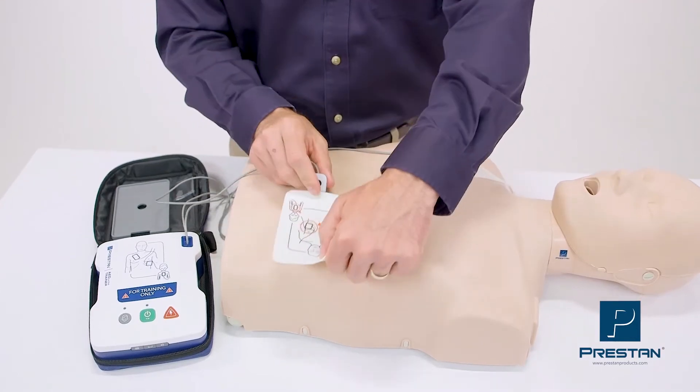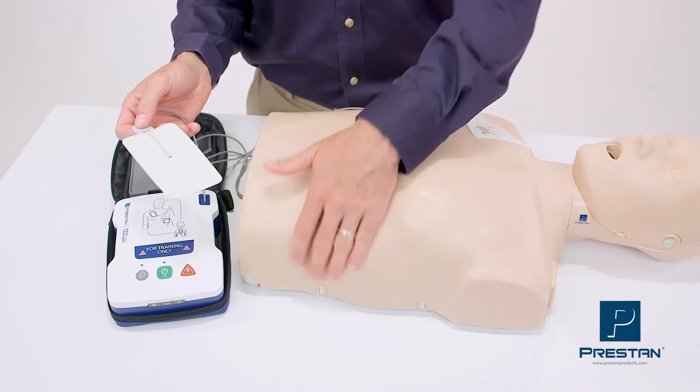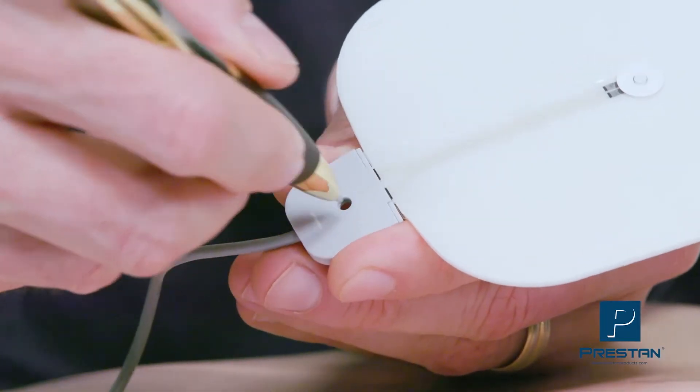Allowing for a more realistic training class. The pads are durable, lasting up to a hundred applications, and do not leave behind that annoying sticky residue. Replacement is easy and affordable.